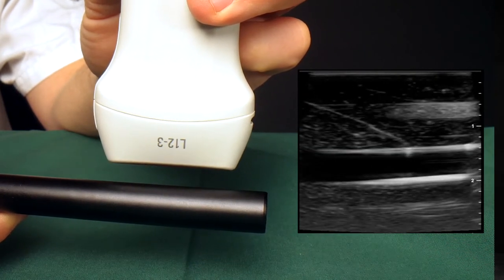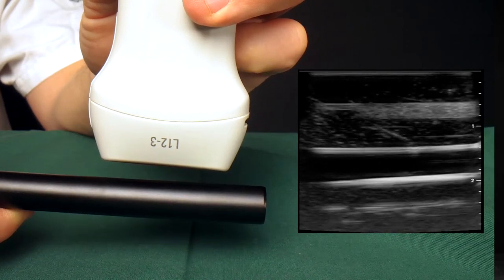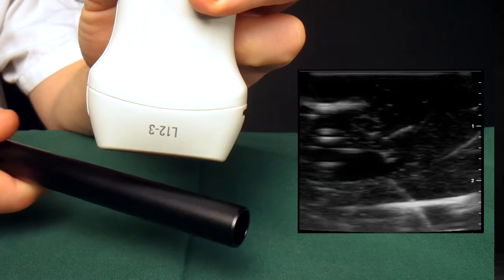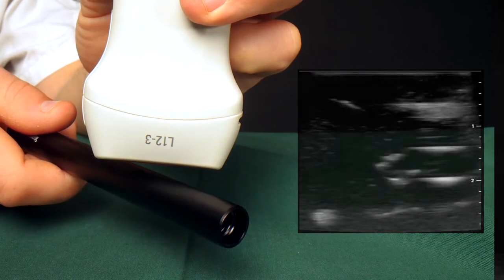The vessel appears as a horizontal bar. There's also a middle way — the oblique view. It's obtained by going halfway between short and long axis. We'll get back to why you need to master this in just a little bit.